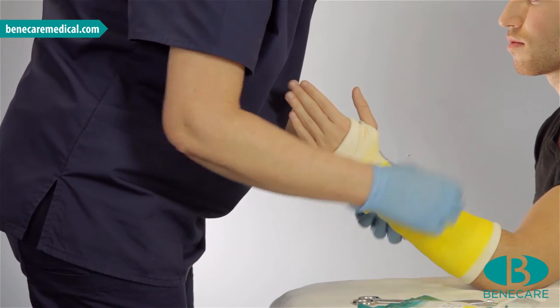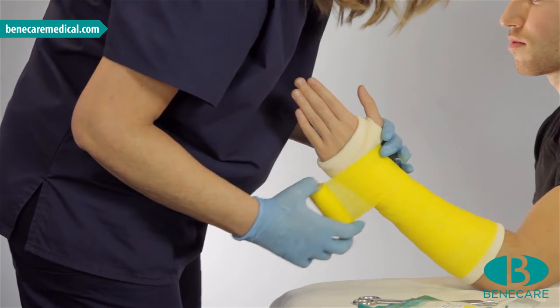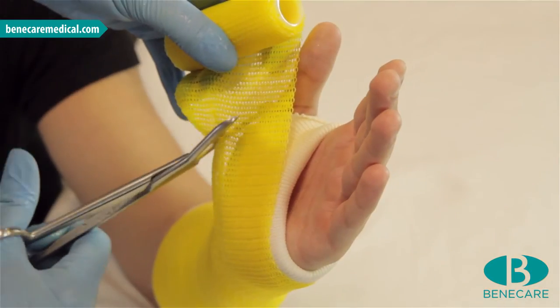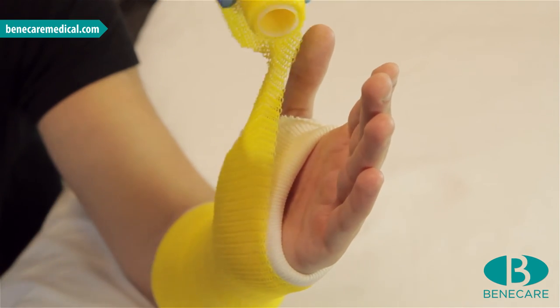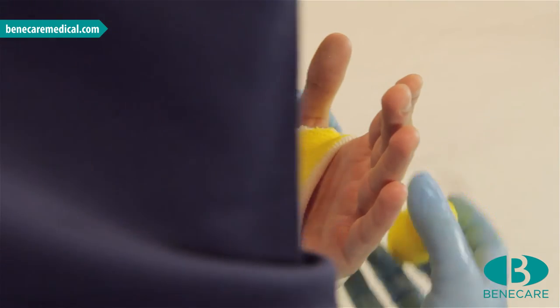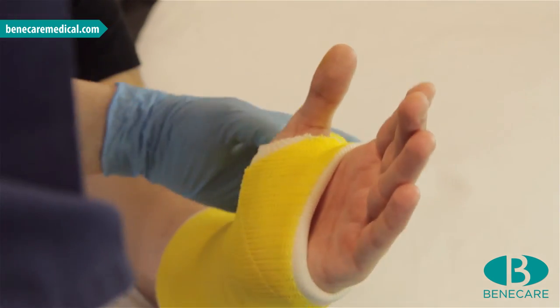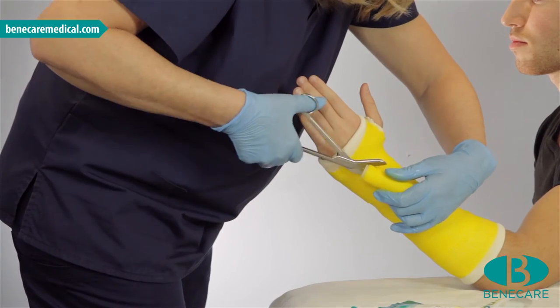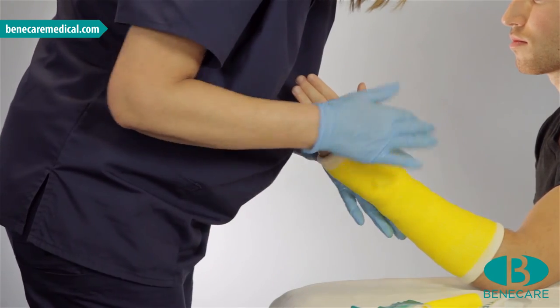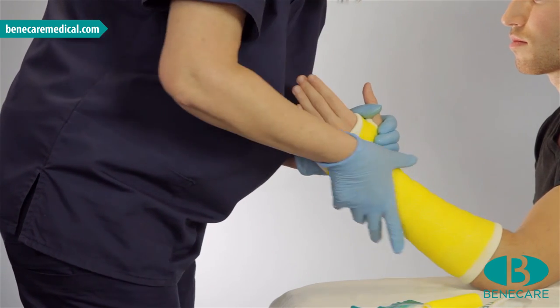Continue along the arm to the base of the thumb. Cut to go through the web space only once. Continue around the wrist and capture the loose ends, then cut off the roll. Now mould the cast well. This will ensure excellent lamination, providing a strong well-fitting cast.